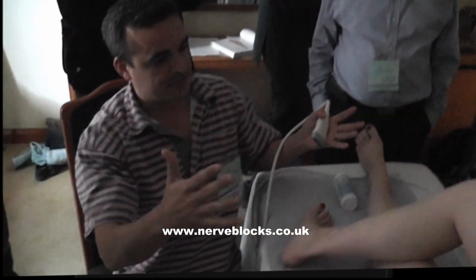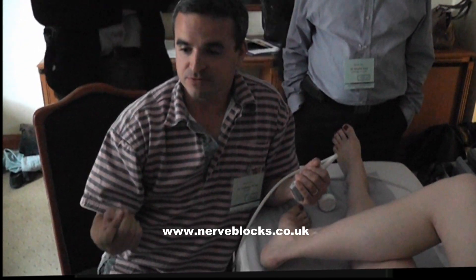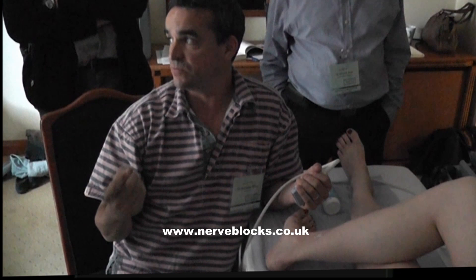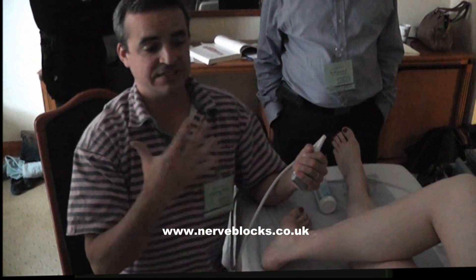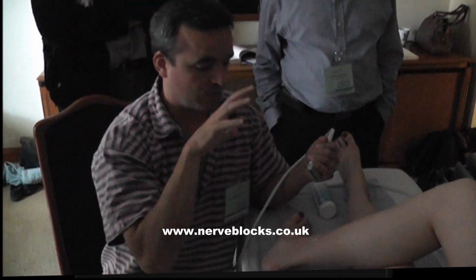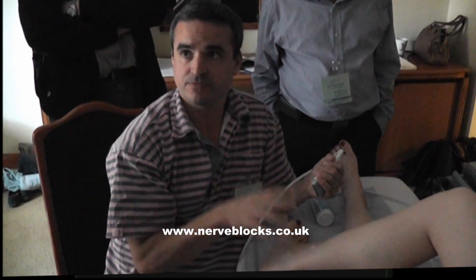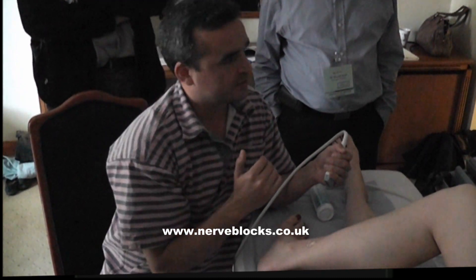So, first of all, the general setup. I'm right-handed, I like to do as much needling as I can with my right hand. So if we set the patient up so I'm standing or sitting on their left-hand side, I can block all the nerves on both feet from this position, which minimises the amount of moving equipment around the room.